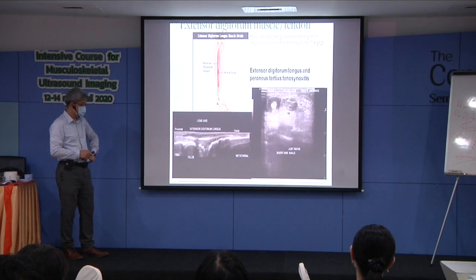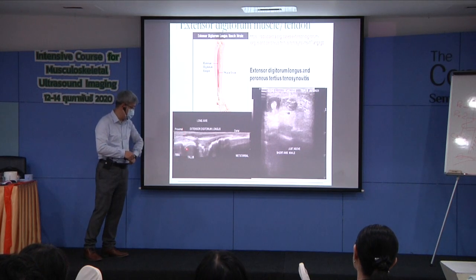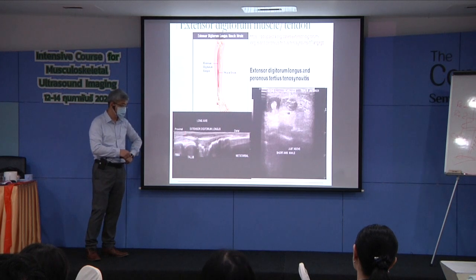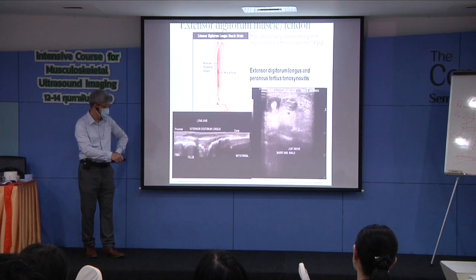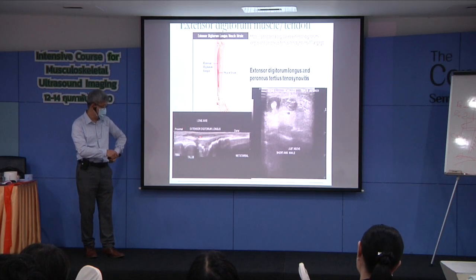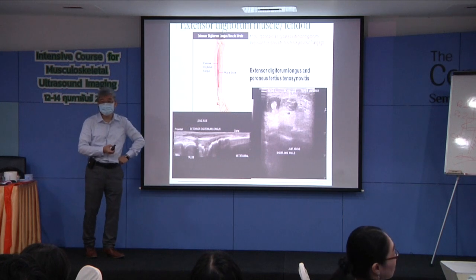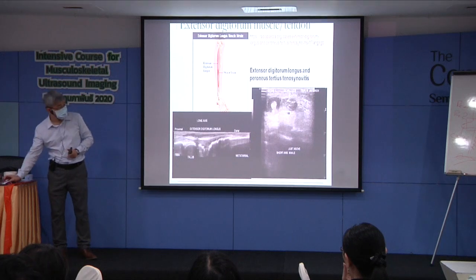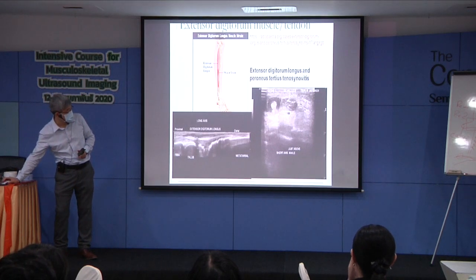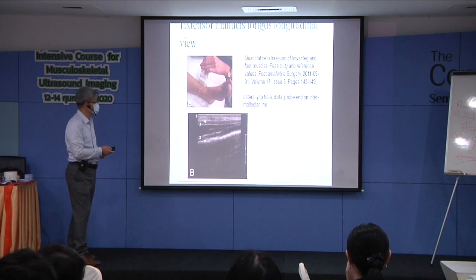That's the tendinopathy. If you observe any picture like this, please always put the power or the color Doppler on the tendon, so you check whether or not there is vascularity in this hypoechoic area. If there is, it is active inflammation. Reducing the inflammation is the first priority treatment for the patients.